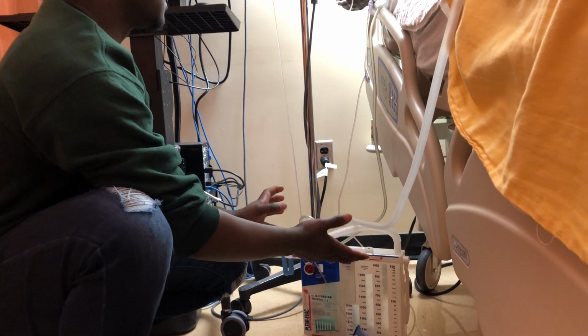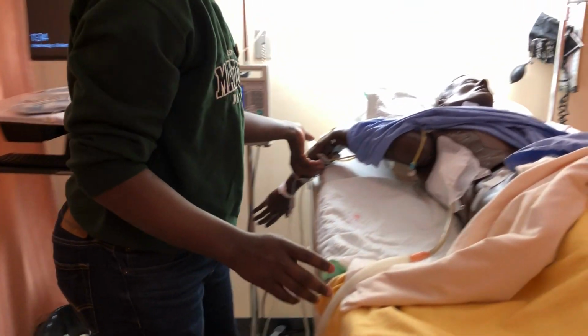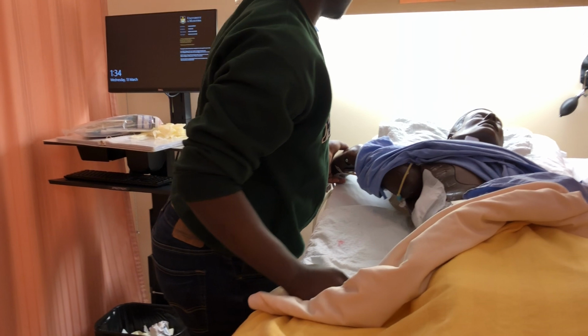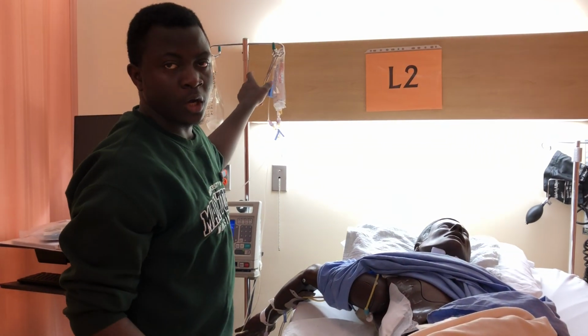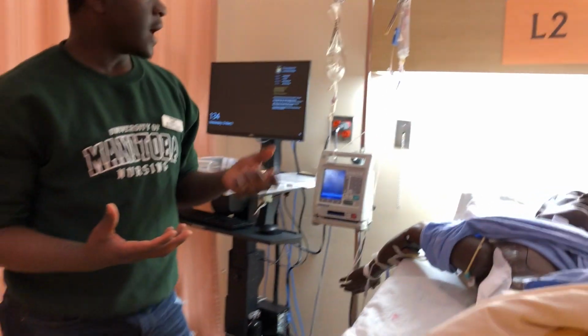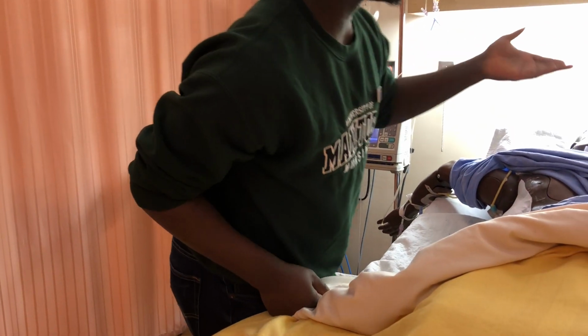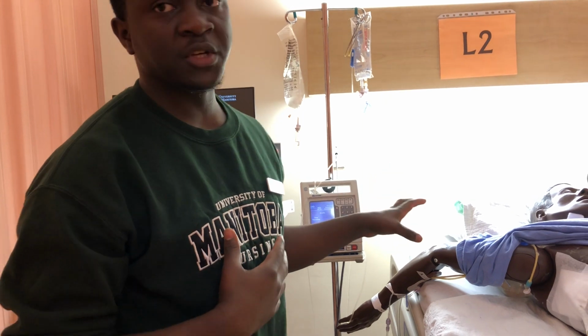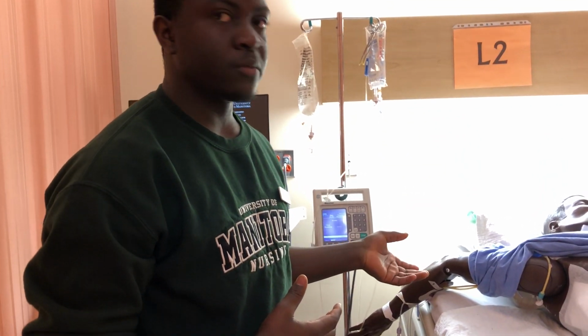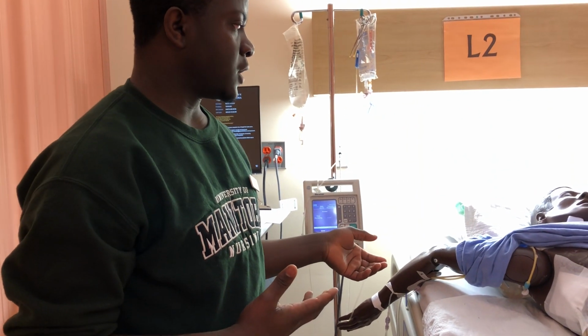So I'm done with all my safety checks. I also make sure to see that there is an emergency box with two clamps and normal saline. I see the clamps here, but I do not see any normal saline in the patient's room. So I will be bringing normal saline. As I do this dressing change, I will bring in some normal saline to leave in the patient's room to make sure that if there's any emergency, he'll have normal saline in the room.